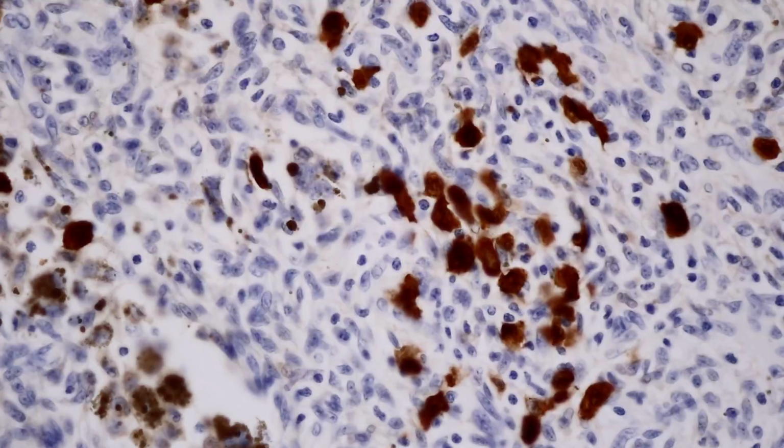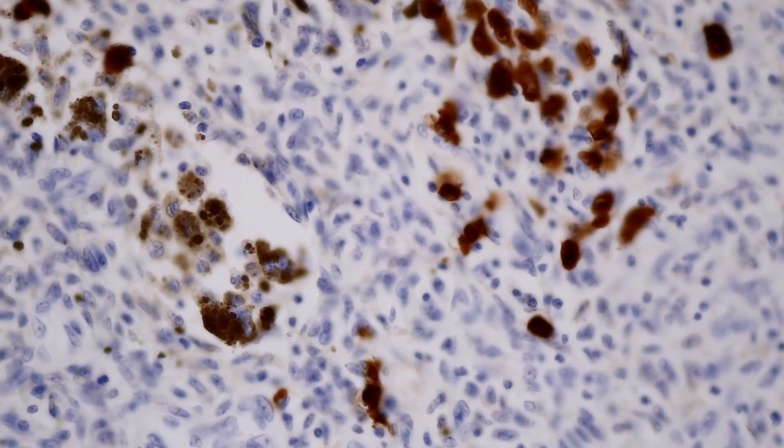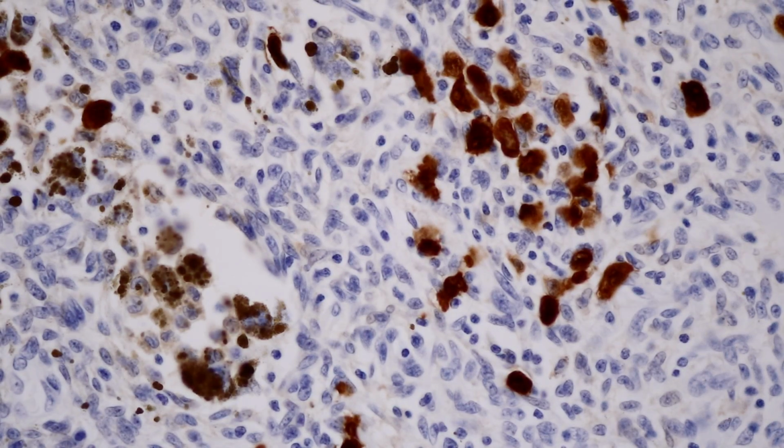Again, after this video, hopefully you would look at a lesion like this and recognize that with looking at all the features, you probably don't need an S100 stain here. But if you still feel like you're concerned about a melanocytic neoplasm and you wanted to do an S100, just recognize that this is a potential pitfall.